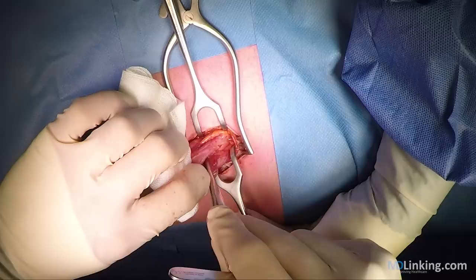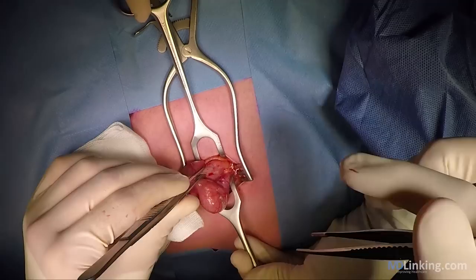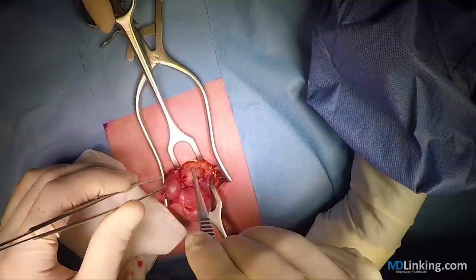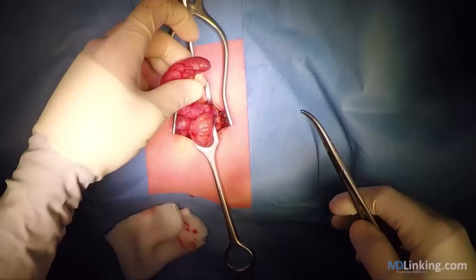So with the index finger we've identified the appendix, and you could also feel that it's inflamed. And by gently pulling we try to deliver it — and there it is.